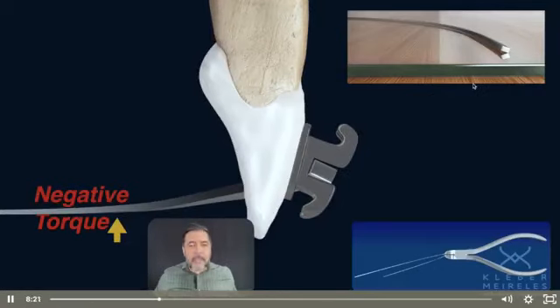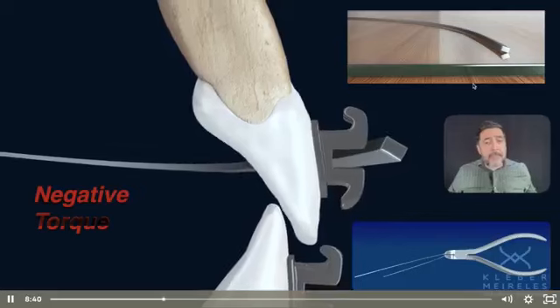But we need to be aware of this. It will depend always on the inclination of the upper anterior teeth or lower anterior teeth, if you're applying the torque in that area. But I'm giving you a spoiler here, because this is something for the next class. Look at this. For the anterior segment, it's going to be a real negative torque.